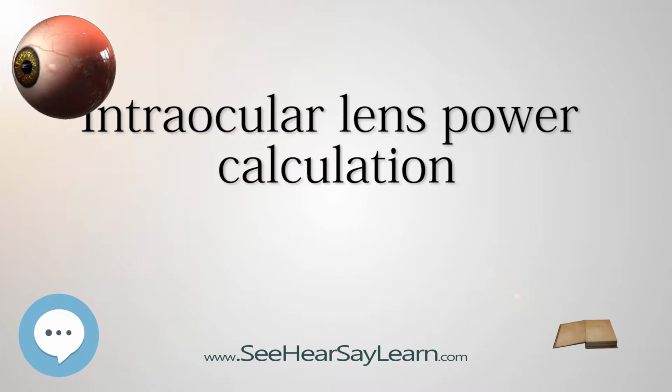Two types of A-scan ultrasound biometry are currently in use. The first is contact applanation biometry. This technique requires placing an ultrasound probe on the central cornea. While this is a convenient way to determine the axial length for most normal eyes, errors in measurement almost invariably result from the probe indenting the cornea and shallowing the anterior chamber. Since the compression error is variable, it cannot be compensated for by a constant. IOL power calculations using these measurements will lead to an overestimation of the IOL power. In shorter eyes, this effect is amplified.